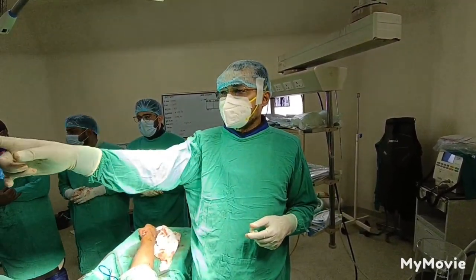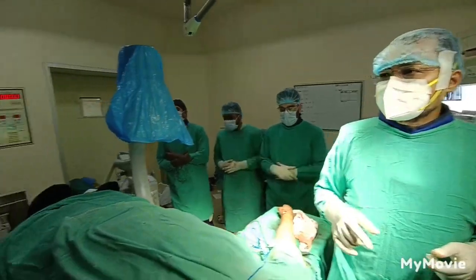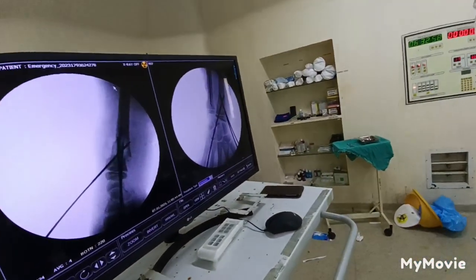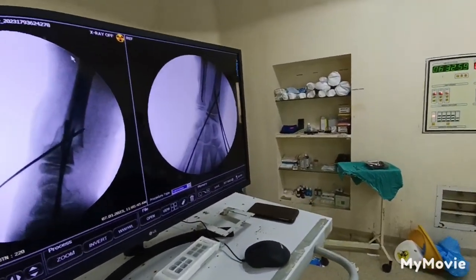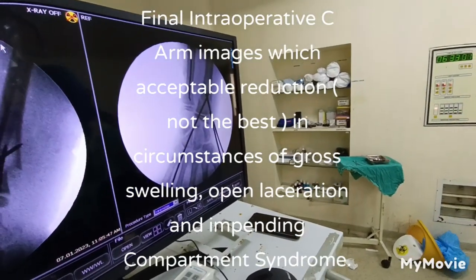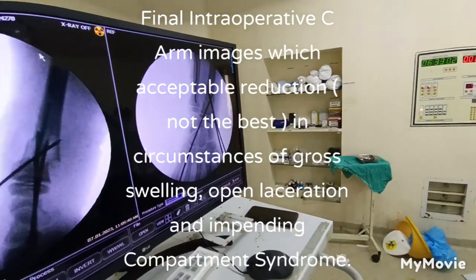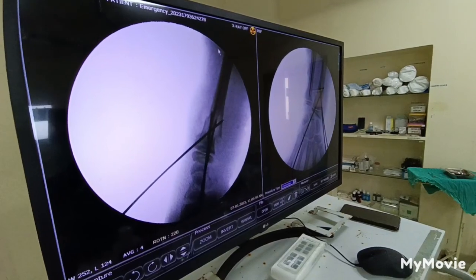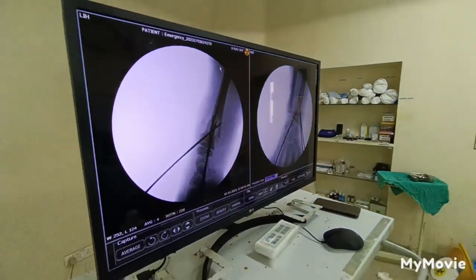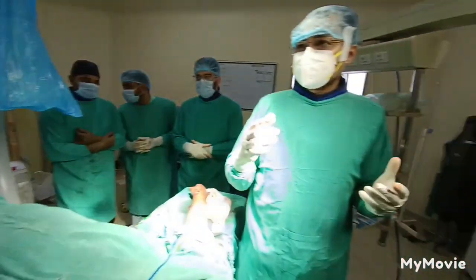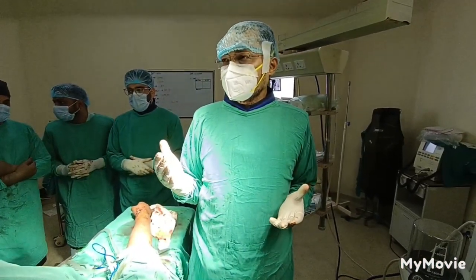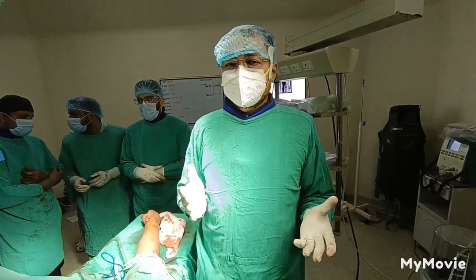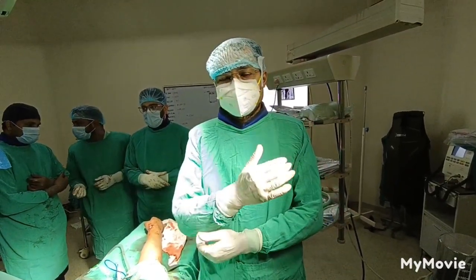And now this is the final picture, which is in an acceptable range. Considering the fact that there is a wound over the volar aspect, we did not want to open the radius. So this is acceptable. Now I will do the final dressing and put the patient on the slab.